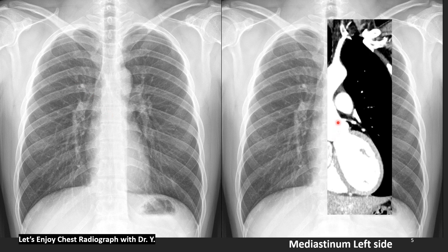This is a contrast-enhanced chest CT coronal image. We are looking at the left margin of the mediastinum. This is the left subclavian artery. This is the aortic arch, which can also be called the first mogul — 'mogul' meaning a small mound of snow. This is the pulmonary trunk, also named the second mogul.